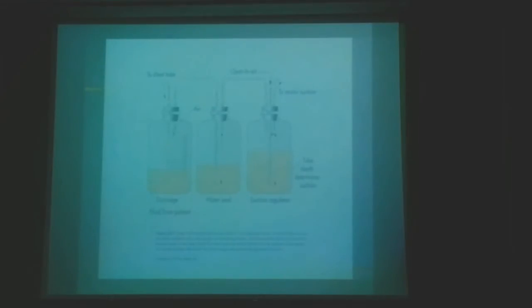You know the chest drain is called an underwater seal. Why? Why do we call it underwater seal? Because the tube is under 2 centimeters of water. Okay, which tube? I will tell you that. So delete this and delete this. Consider this tube, this one. Did you see? It's obvious. Consider this tube is going from the patient itself. Okay? This is from the patient, and this one is open to the air.